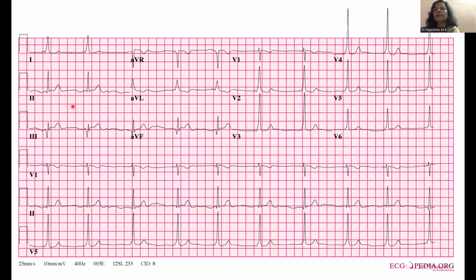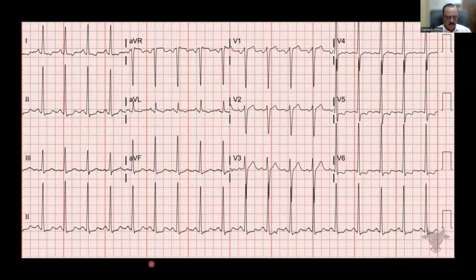WPW syndrome. Superb. Excellent. It's a WPW. Everybody? Yes, sir. I want everyone to recognize this. It's a WPW syndrome. Good. What is this?